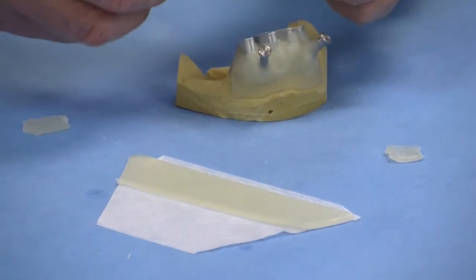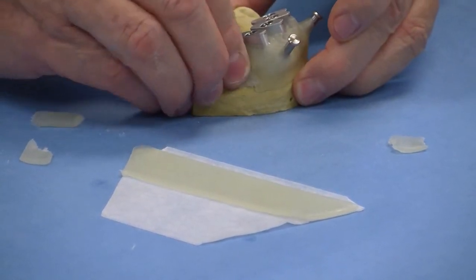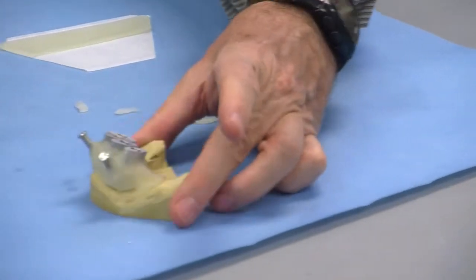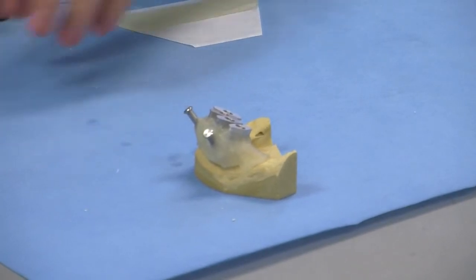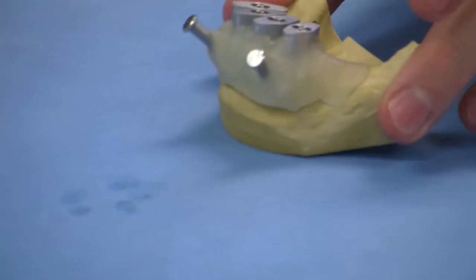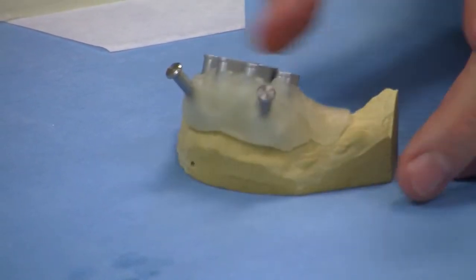A distal stabilization table could also be added on each side. This is pretty much what you want to achieve in terms of size and volume of Triad. Try to cover the entire apparatus as well as the Luxatemp frame.